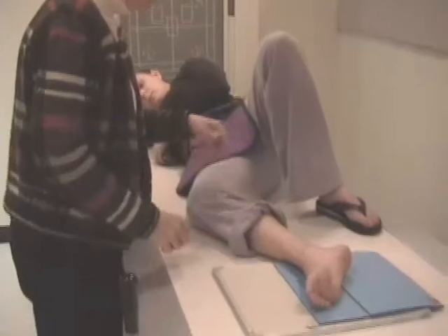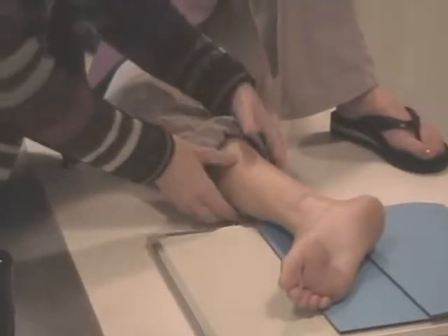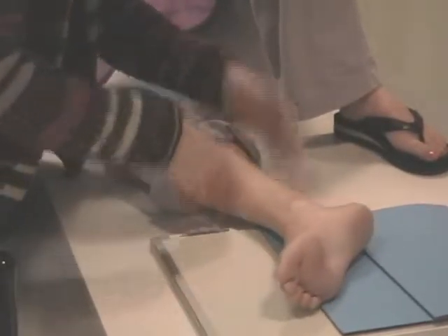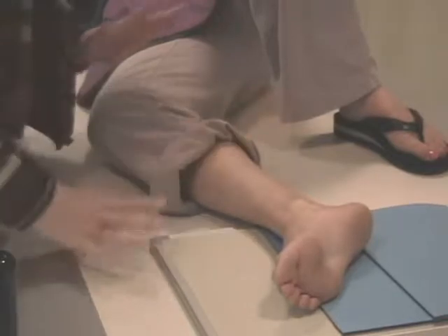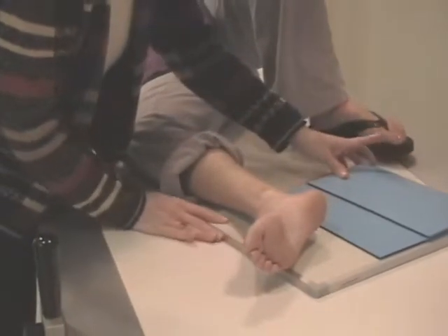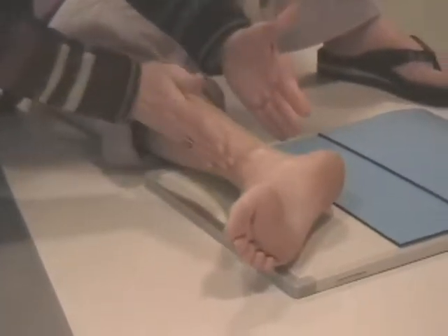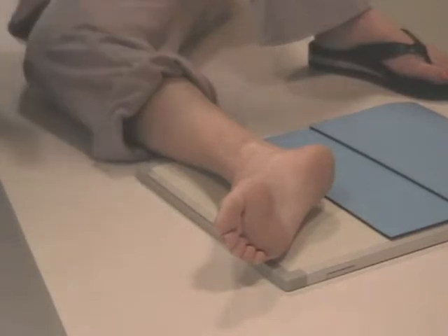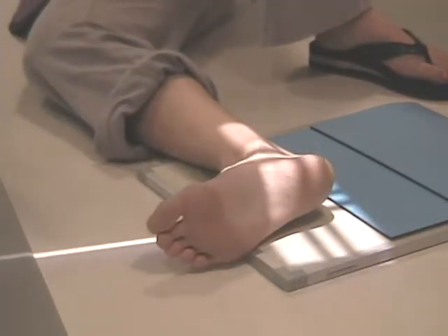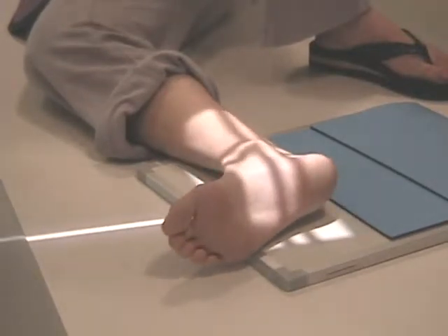Lateral position, her leg is... I'm not going to make her come to the shape of my cassette. I want to go make her comfortable, and that's how she naturally laid. So I'm going to turn the cassette to match her shape. And you can see now that the cassette is parallel to the lower leg here. And I will be adjusting my collimated area to that field as well, fixing my central ray to where it exits to the center of the film.